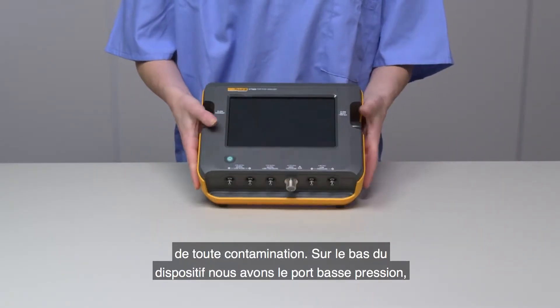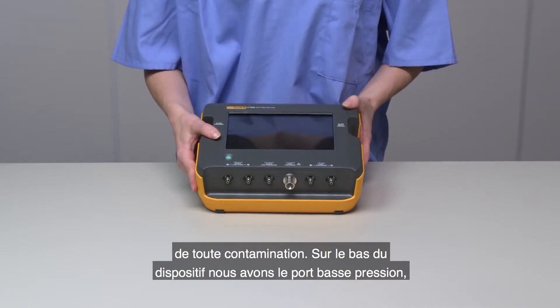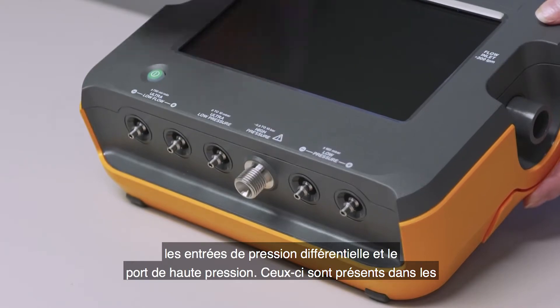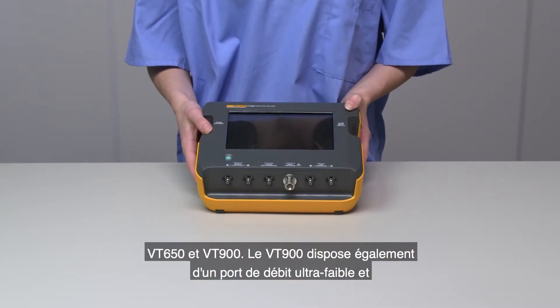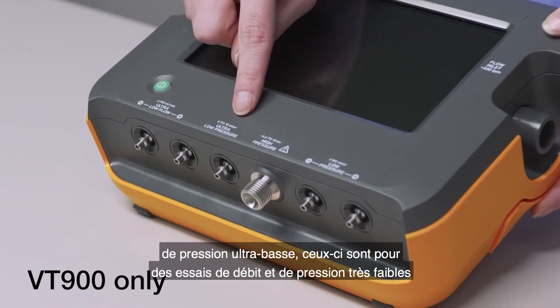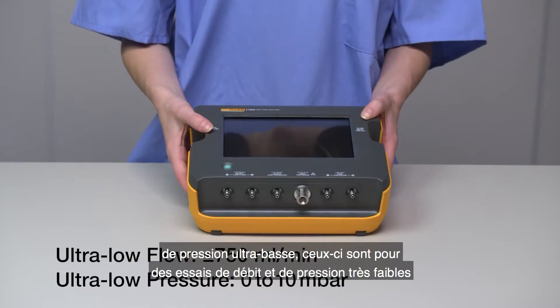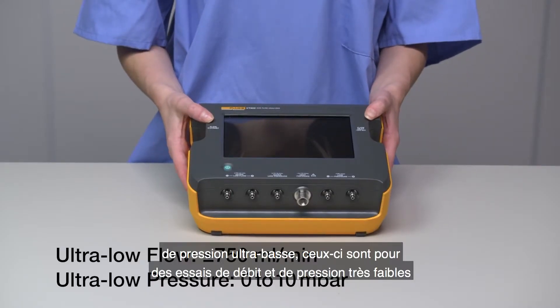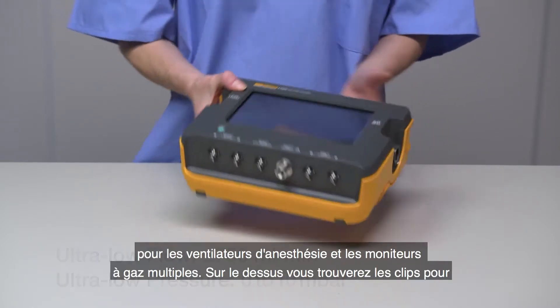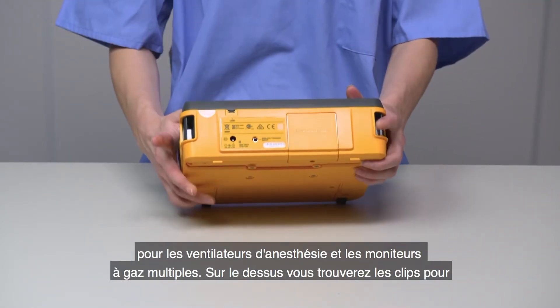On the bottom of the device, we have the low-pressure and differential pressure ports, and the high-pressure port. These are present in both the VT650 and VT900. The VT900 also features differential ultra-low flow and ultra-low pressure ports. These are for very low-flow and pressure testing that require critical high accuracy and reliability in measurements, like anesthesia machines and multiple gas monitors.